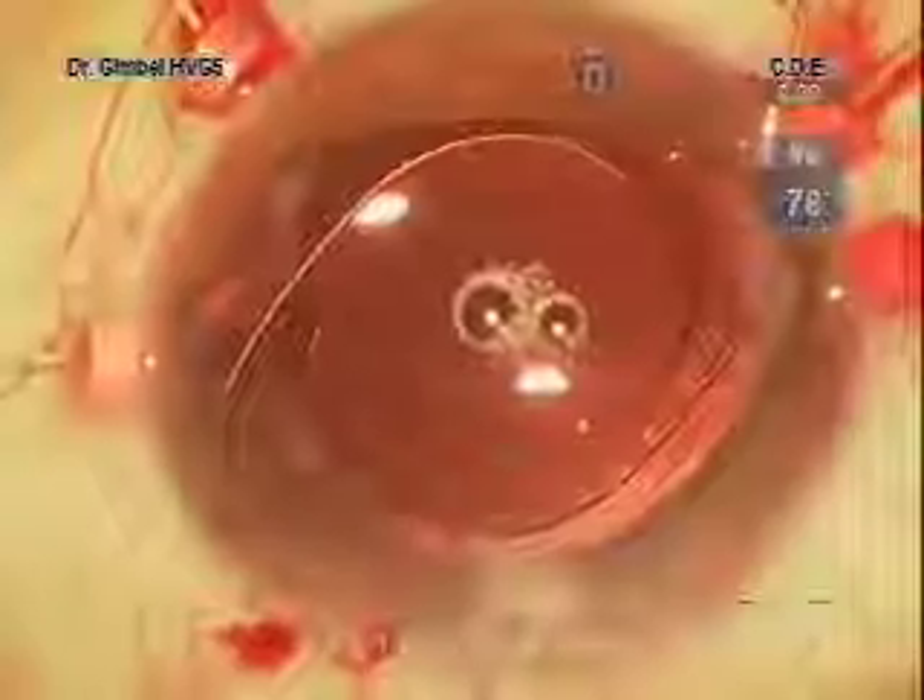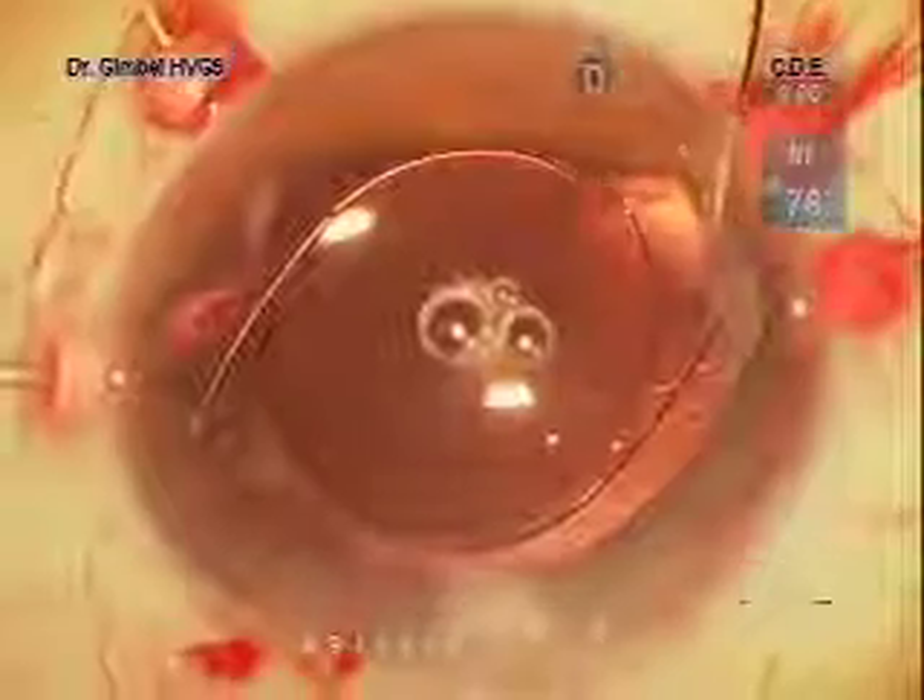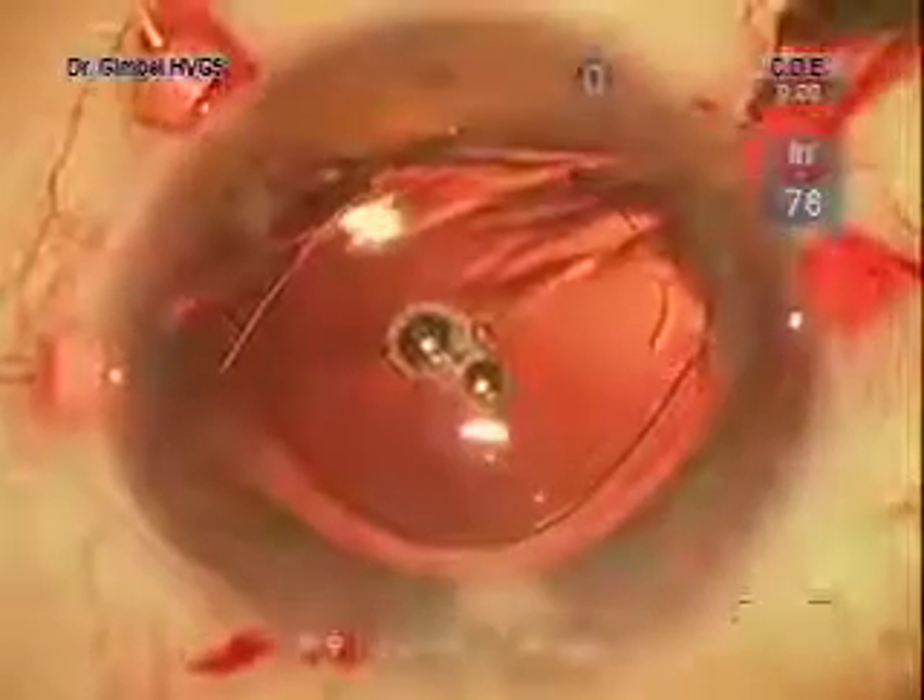I've repositioned it here now to a location where the haptics are overlying the membrane that can be accessed for suture placement. You see the suture entering, going through the capsular membrane, under the haptic, and then back out again into the chamber. To exit, I've made a paracentesis opening, and we're going to thread the needle onto a 26-gauge cannula to guide it out of the paracentesis opening.